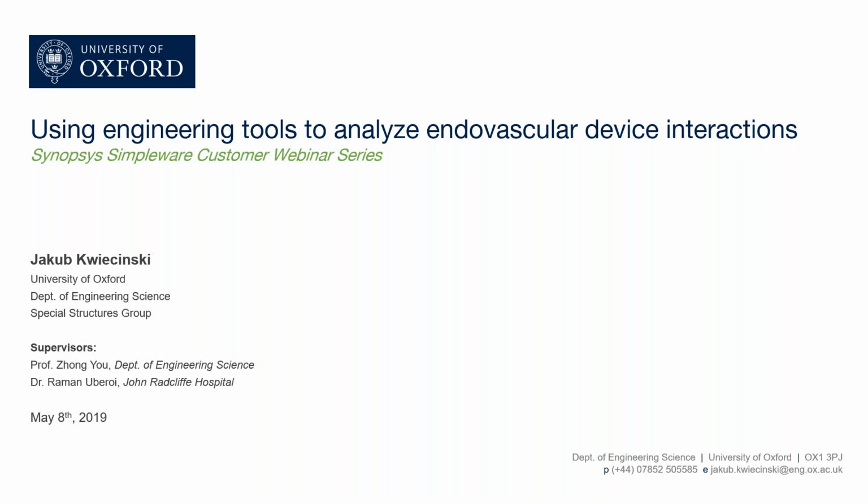Now, today the talk is going to be purposefully broad. I think we have quite a broad audience, so I don't want to focus too much on specific details. What I'm hoping to share with you is both some experimental and computational tools that we've been working on implementing here, and I think those in the audience are perhaps most interested in how we used Simpleware ScanIP to really quantify some of the behaviors we're most interested in.